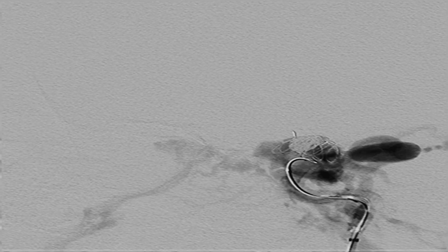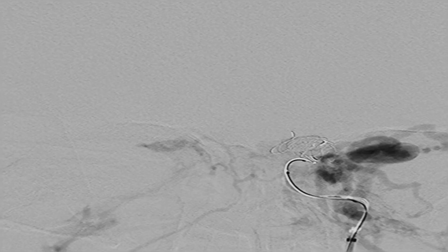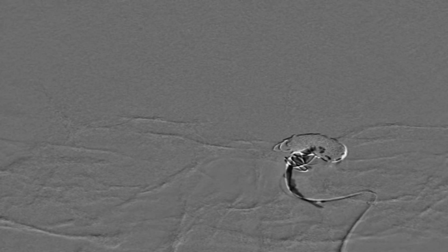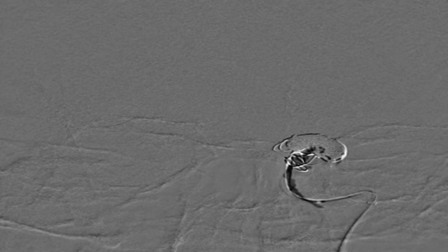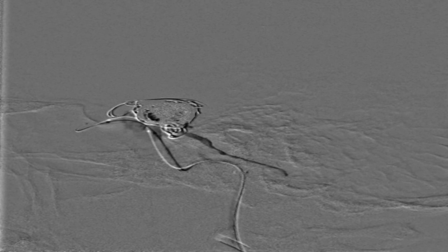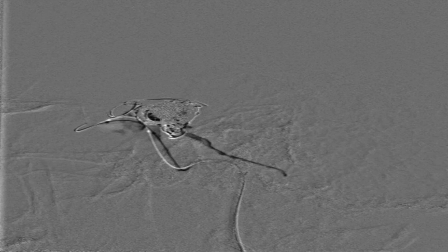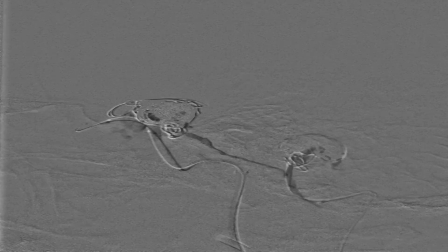Post packing with multiple coils, fluoroscopy showed that dye was still passing through the fistula. Therefore, the next step was to fill the fistula site using a liquid embolizing system delivered through the Echelon micro catheter, which is dimethyl sulfoxide compatible. Note that the balloon remained inflated throughout this process.